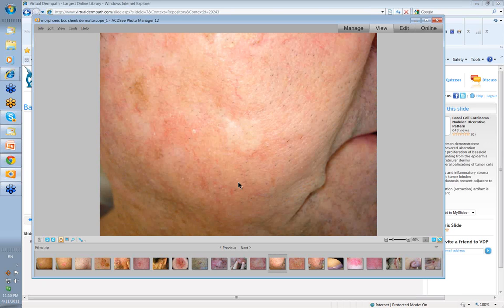The histopathology varies for each of them. Note the depth of the infiltrating BCC here, and the fact that if you were excising that, you really should use Mohs, but you're going to need somewhere between 5 and 7 millimeter margins to take that lesion out with a 90% certainty that you've in fact removed it.